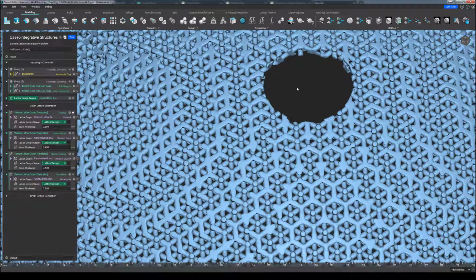beam that falls outside of the lattice design volume, even if this means cutting the beam at a weird angle. However, keep in mind that the small scale of these structures typically makes this not an issue when manufacturing, because the melt pool created by your laser beam or your electron beam will likely give you a rounded beam at the end of the day anyway.